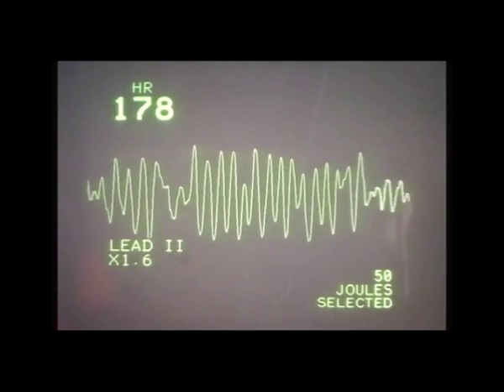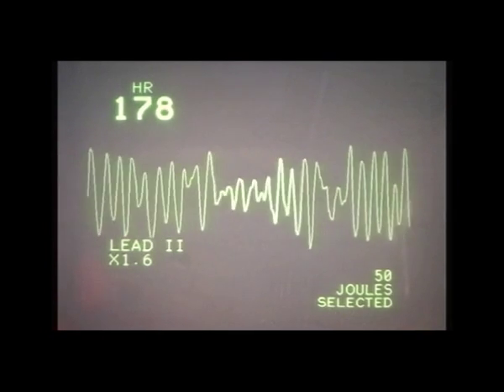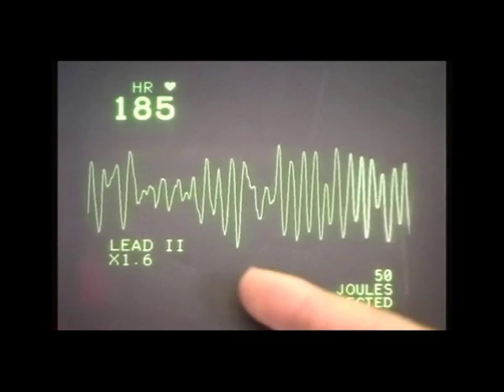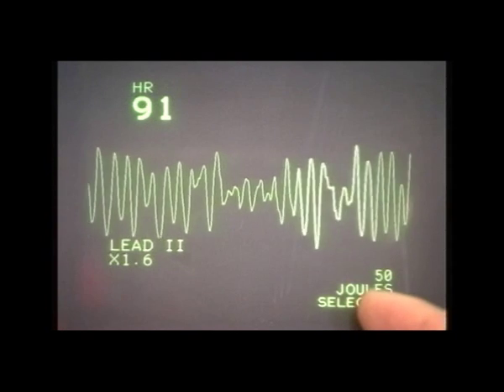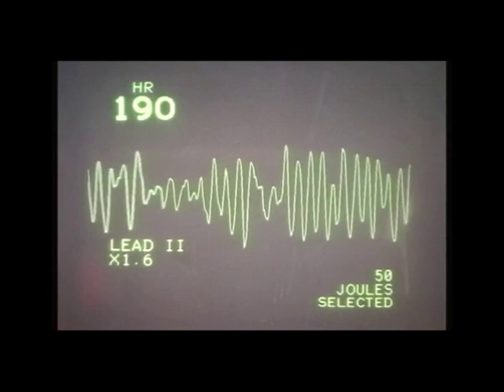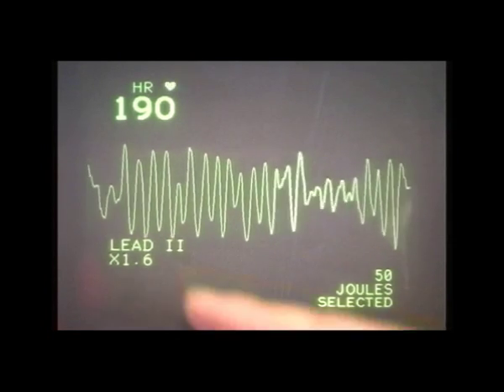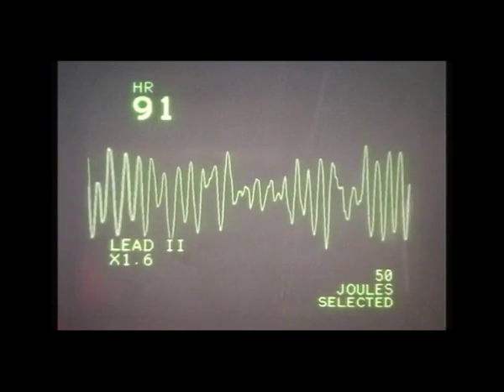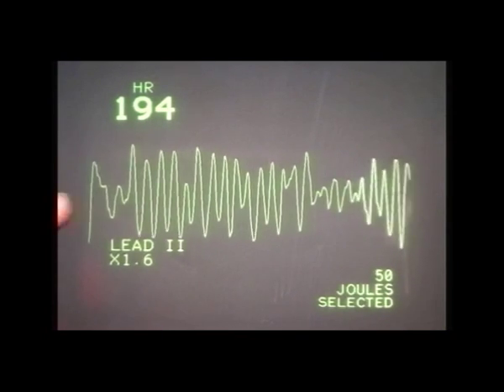So, we're going to demonstrate it. Right, put the demonstration in. So, what we're seeing here is a chaotic, irregular rhythm of the heart fibrillating. This rhythm would be one of the rhythms that we would need to carry out defibrillation on. As we can see, the amplitude's constantly changing, and there's no discernible pattern to it. Is this mostly generated by the ventricular myocardium?